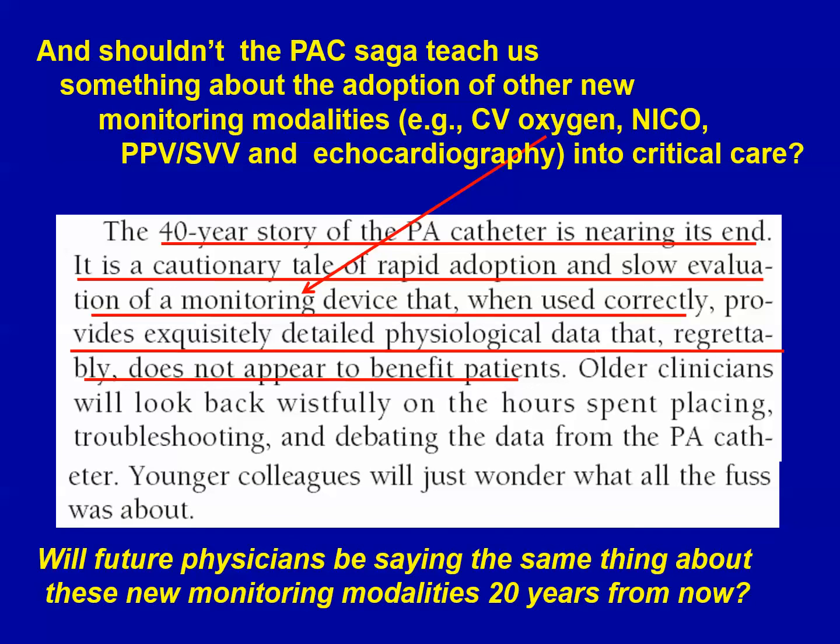Notice in this commentary that I just mentioned, they said that the story of the pulmonary artery catheter is a cautionary tale of the rapid adoption and slow evaluation of a monitoring device that, when used correctly, provides exquisite detail of physiologic information, but regrettably doesn't appear to benefit our patients.